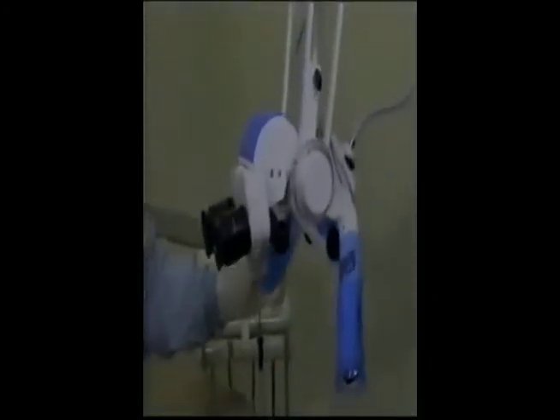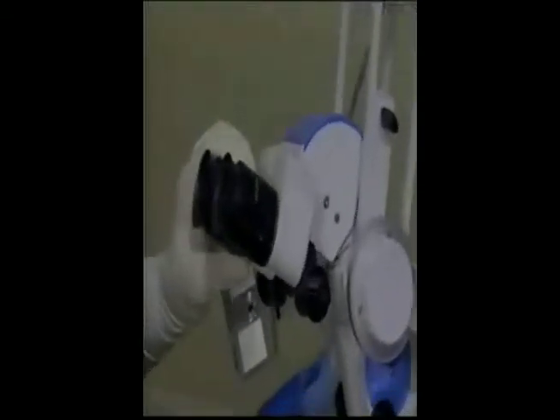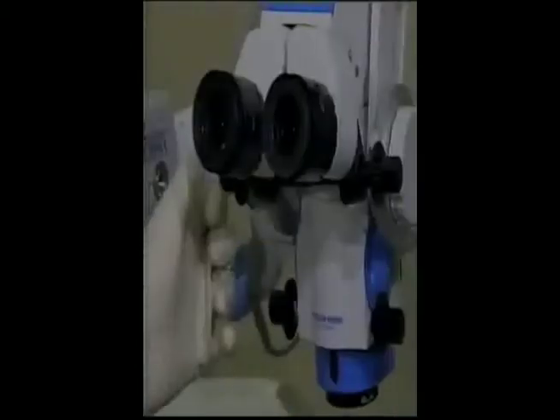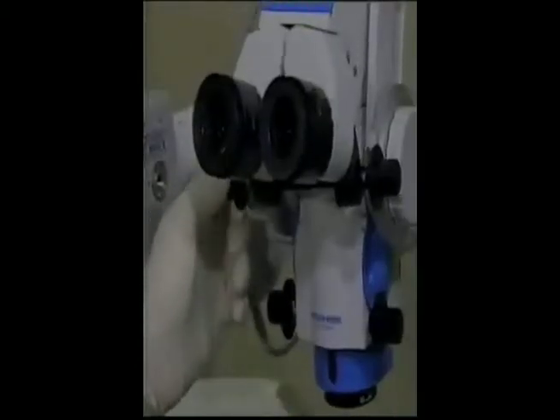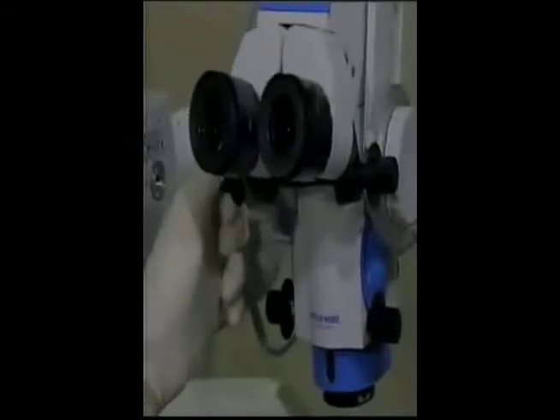Inclinable head and eyepieces mean that the microscope head can be adjusted to fit the way you are most comfortable during a procedure. No need to strain your head or neck to achieve a comfortable viewing position. For even more viewing comfort, the interpupillary distance between the oculars is fully adjustable, thus providing optimum stereoscopic vision.